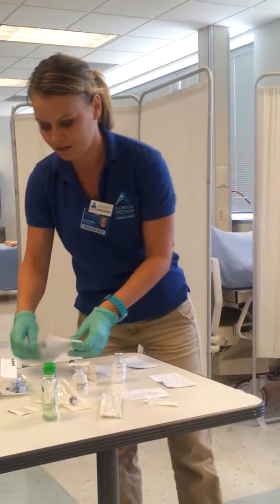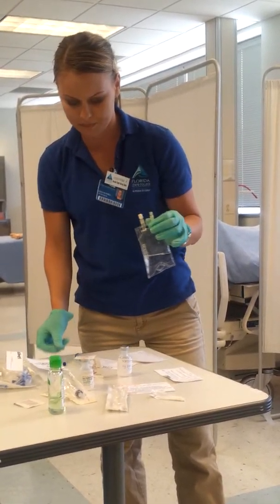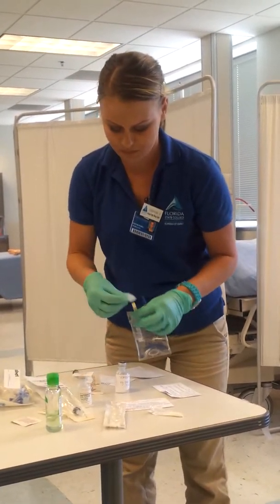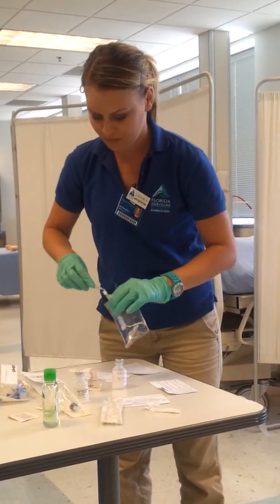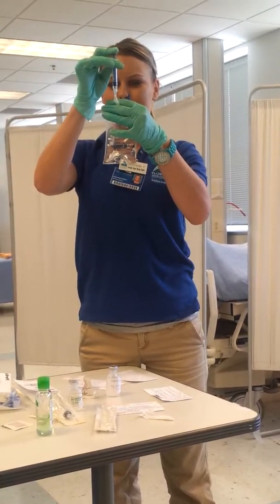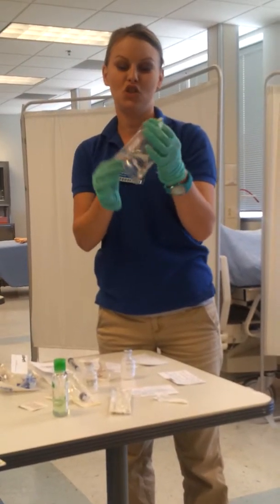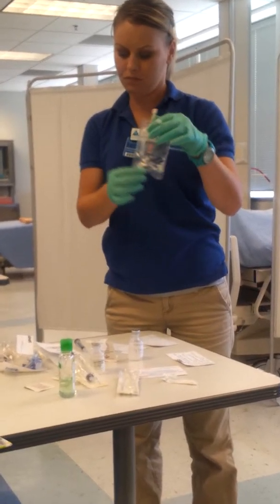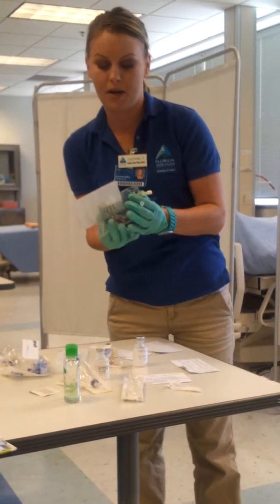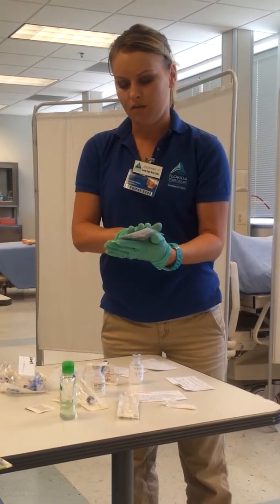Now I'm going to get my minibag — it's 100 milliliters — so I'm going to mix my half a milliliter into my minibag here. I'm going to clean off my port and I'm going to insert my drug. I'm going to gently agitate it. And now I'm going to label my drug with the patient's name, the medication I've inserted, the amount of medication I've inserted, and then I'm going to put the date, time, and initials on the back of the bag.